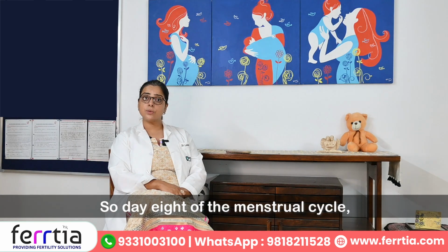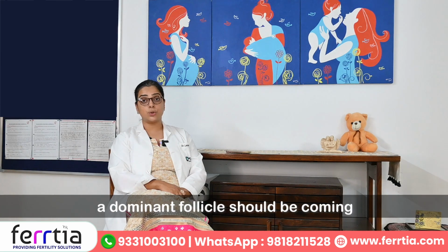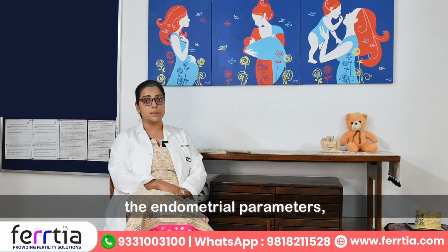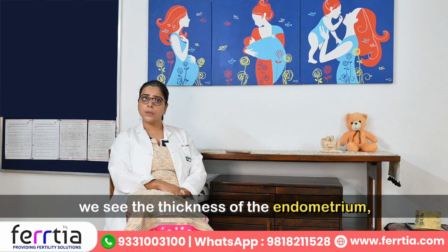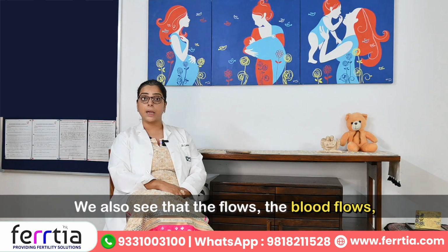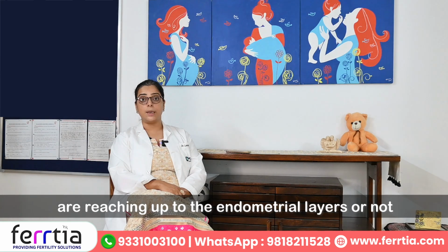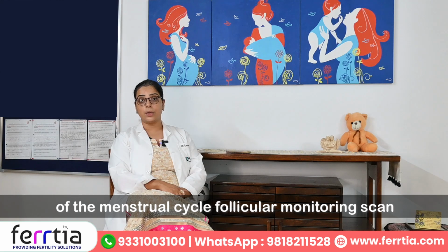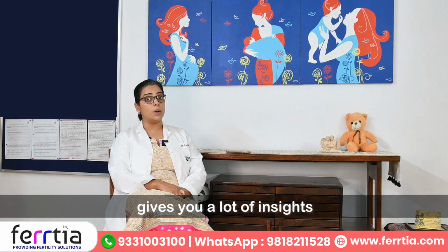So on day 8 of the menstrual cycle, a dominant follicle should be coming, and we also see the endometrial parameters. We see the thickness of the endometrium, we see the grade of the endometrium, we also see whether the blood flows are reaching up to the endometrial layers or not. So this day 8 follicular monitoring scan gives you a lot of insights.